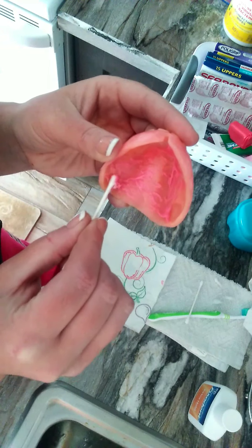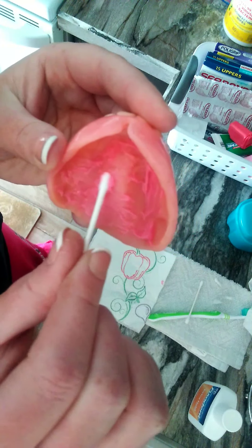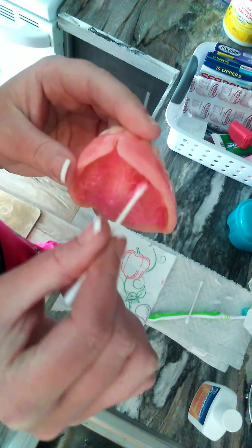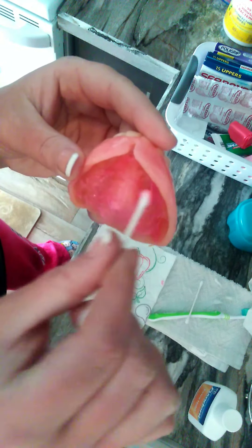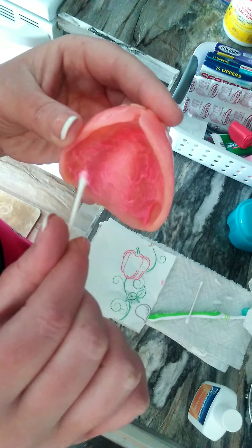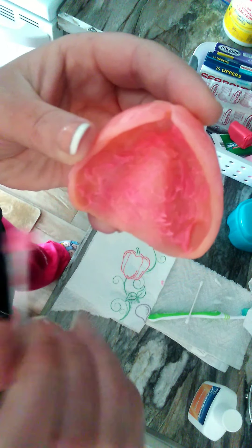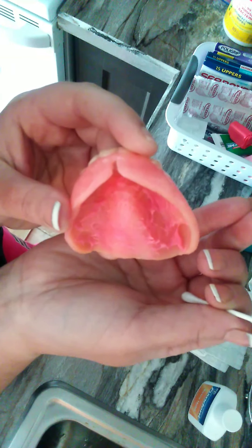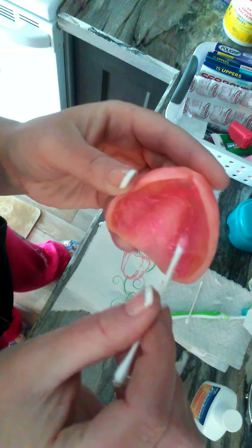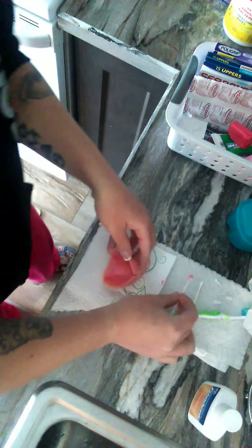Get in the little spots. I have a dip in here — it's like here and then it dips in because of my jaw healing. So I make sure I put some in there, put it all around, make sure I get my palate well because sometimes my palate is not my friend. Do not put it so close to the edge — I left a section. Because I'm spreading around I can get close to it, but if you do not spread around, do not go past right here. Because once you press down, it will ooze everywhere and then you'll start eating your adhesive, and that sucks. That's a bad day.